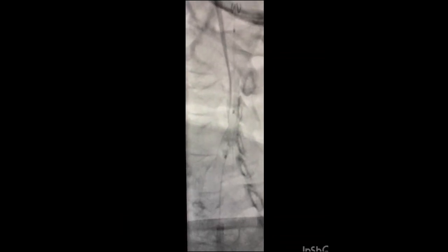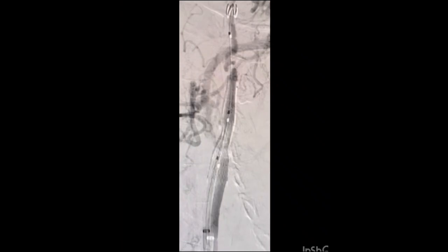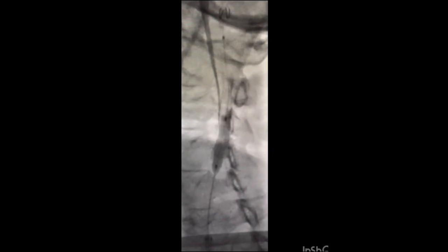The thought process at this point was to do a balloon plasty and give dilators to relieve the vasospasm. We also acknowledged the fact that the collateral was so good that the forward flow in this artery had significantly dropped. Post removal of the filter, the forward flow had improved.